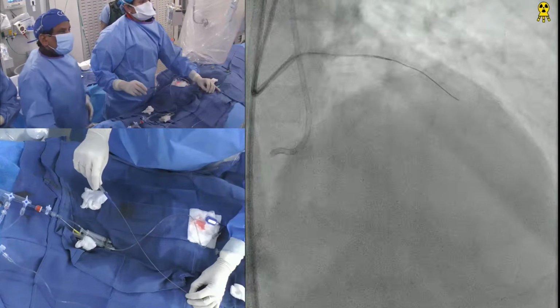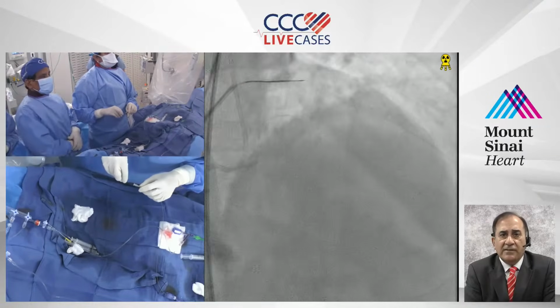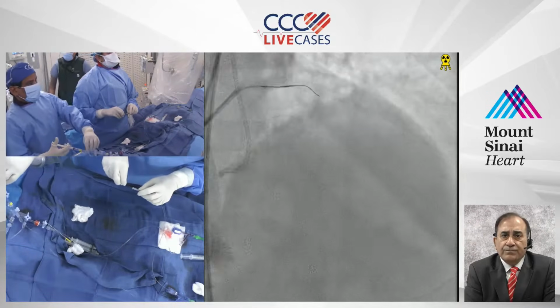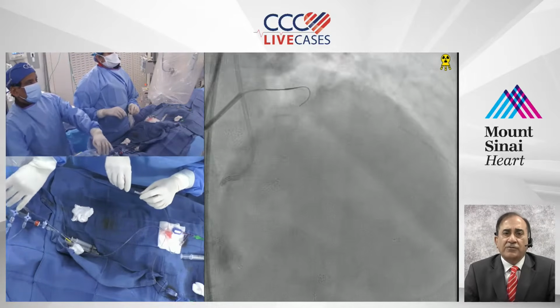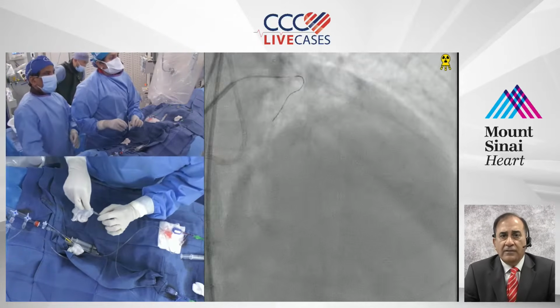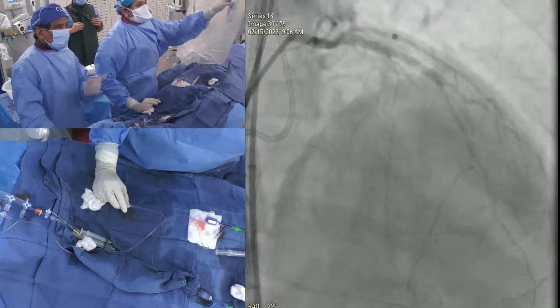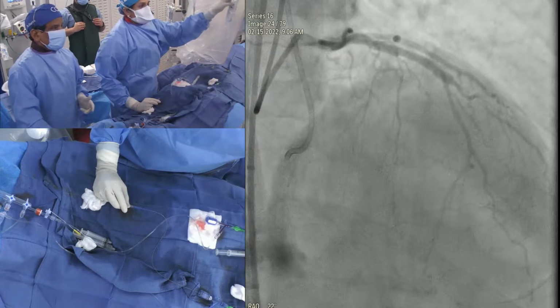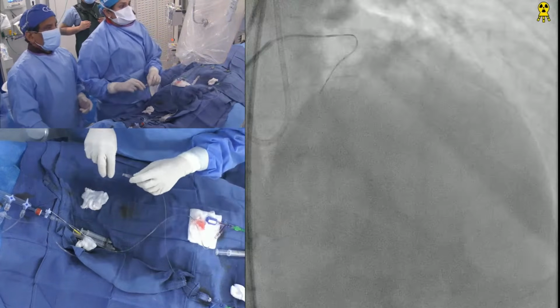So Anu, the real decision to move away from the distal septal is because of the inability to advance the Corsair? Yeah, which we knew. There are two things. This is also a very tricky approach, a very angulated septal. I think it's in a different path. No, this is a very early septal. You want to go to the second one? That one is not going either, in the mid portion of the stent. Yeah, that's right. Even that doesn't have a very clear path.